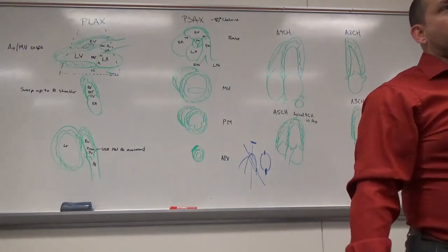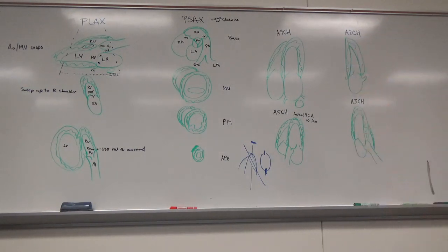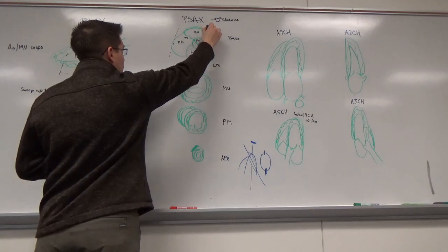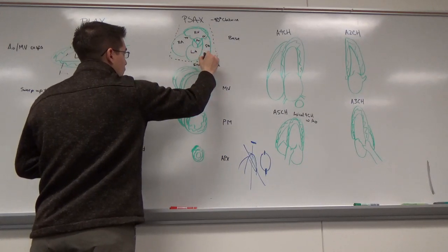And we'll talk more about those later, but it's important to know the anatomy, because that's when you see stuff that's not right, we need to point it out. Do you usually put color over that? Yes. And I know sometimes it bleeds over. Is it real obvious?